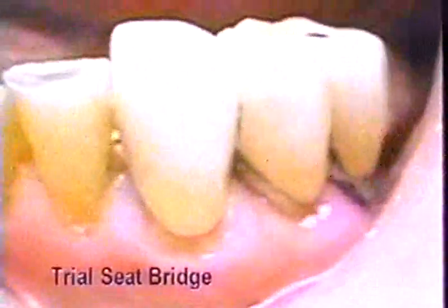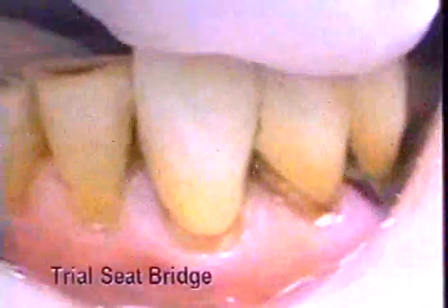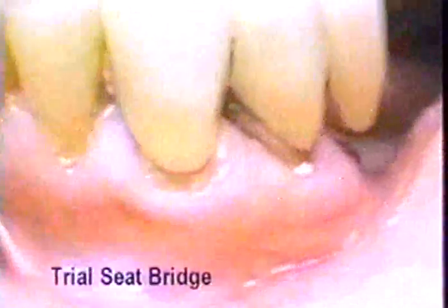The old bridge, which was used as a temporary, is now trial seated in the mouth. Here we can see that it does not fully seat onto the teeth. We have placed marking spray in the crown and reseated the bridge. When the bridge is removed, the high spots and areas of impingement on the post are colored green. The green spots on the post are relieved and the bridge is tried in again for fit.